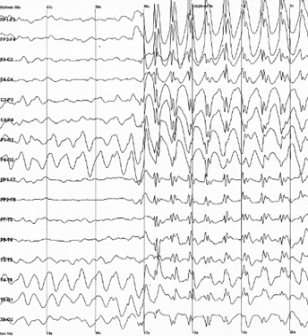The EEG signals can be captured with open-source hardware such as OpenBCI, and the signal can be processed by freely available EEG software such as EEGLAB or the Neurophysiological Biomarker Toolbox.